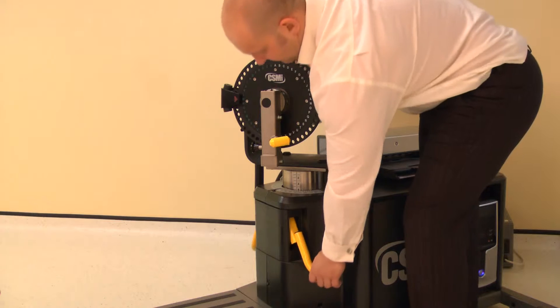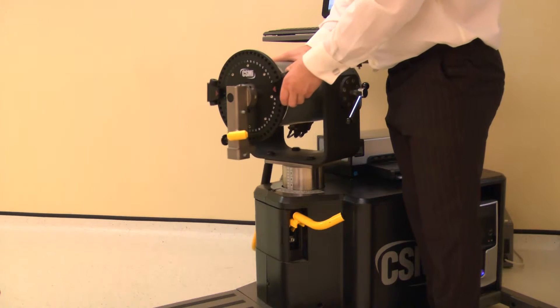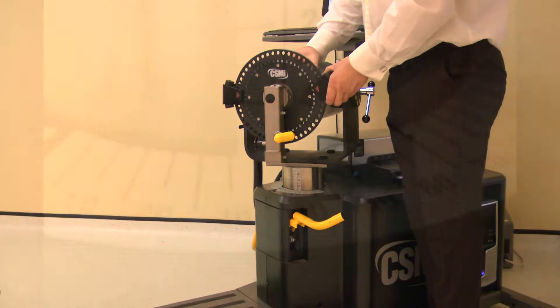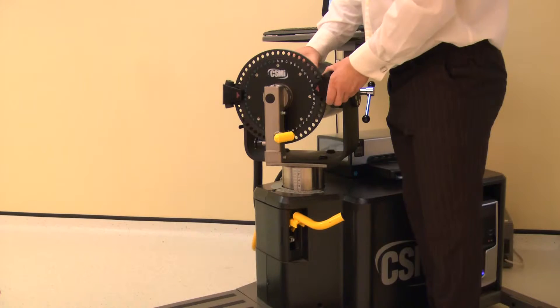The dynamometer height and rotation are adjusted together. Lift the locking handle to release. For the right knee, rotate the dynamometer to 40 degrees on the black scale, whilst also adjusting the height to 5. Ensure both locking handles are pushed down to secure.